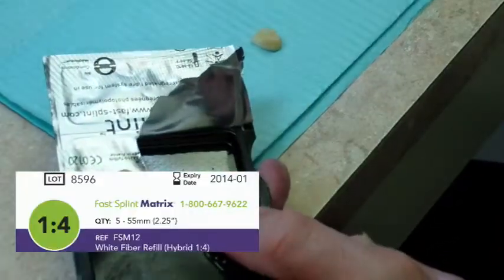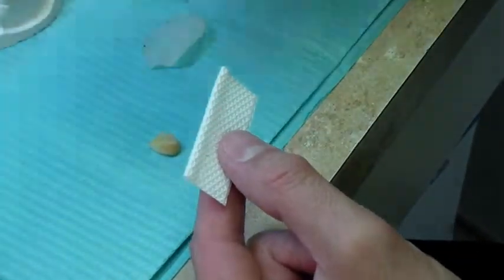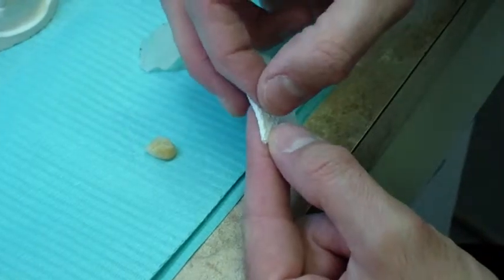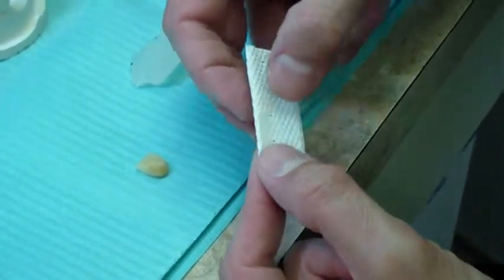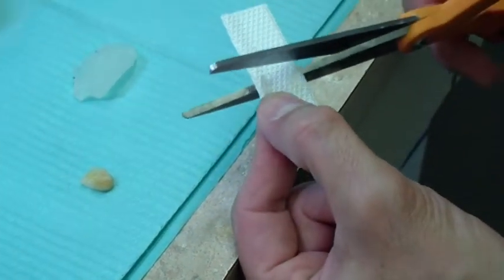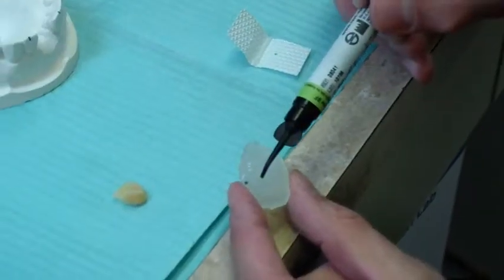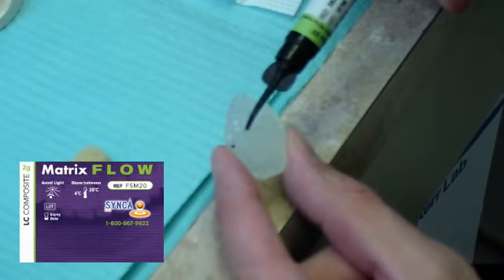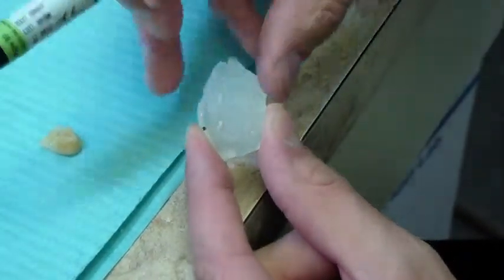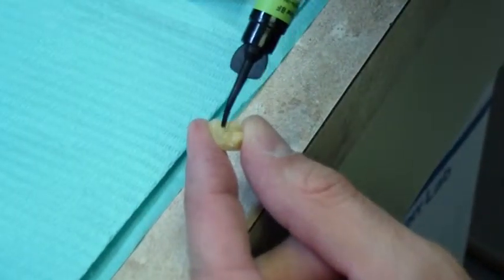Remove a piece of Fast Splint Matrix 1-4 glass fiber from the package. Cut the fiber with the protective plastic wrapping in place. Fill the trough or channel in the index with a very thin layer of Fast Splint Matrix flowable resin. Fill the horizontal and vertical channels of the denture tooth with a generous amount of Fast Splint Matrix flowable resin.